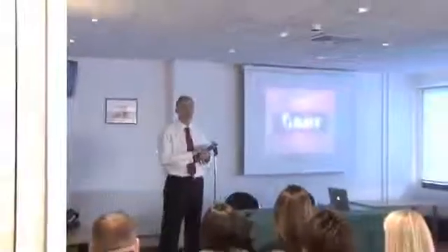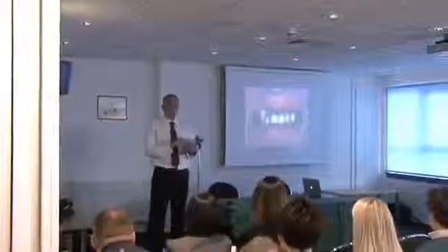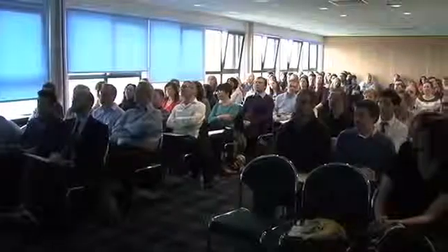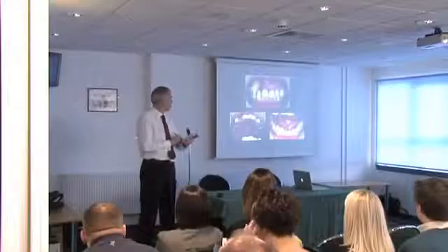Before I explain how it's done, let me show you a case to hopefully get your attention. A challenging case in anybody's book. High smile line, periodontal involvement, and the teeth that are okay are in the wrong place. Lower arch, we've got a short dental arch down here. That's what I mean by short dental arch. We've got 5 to 5. It's kind of stable. I'm not that worried about that.